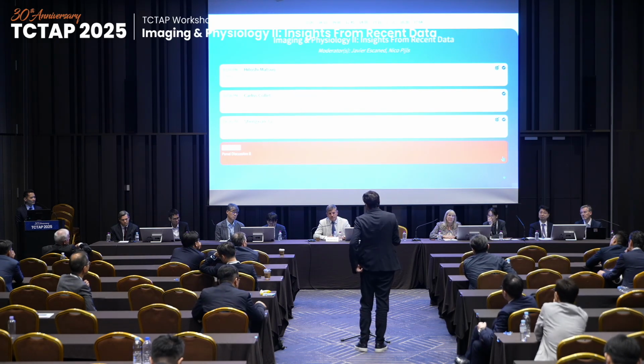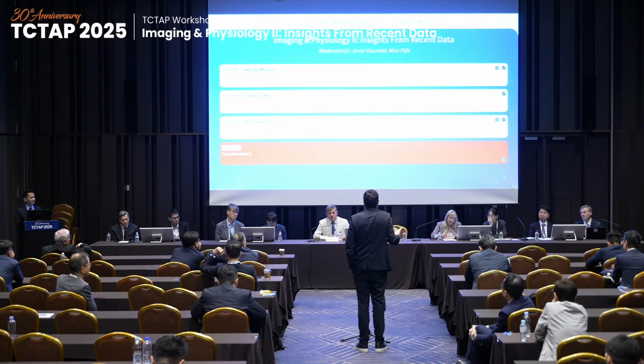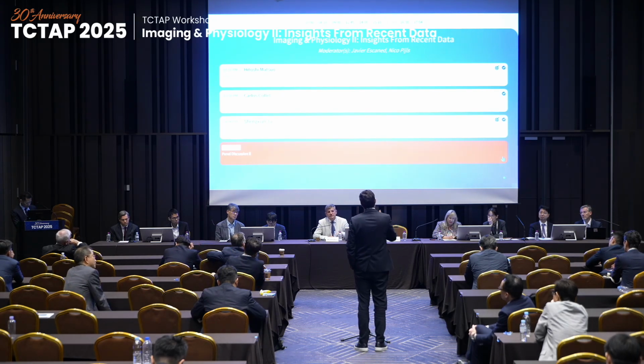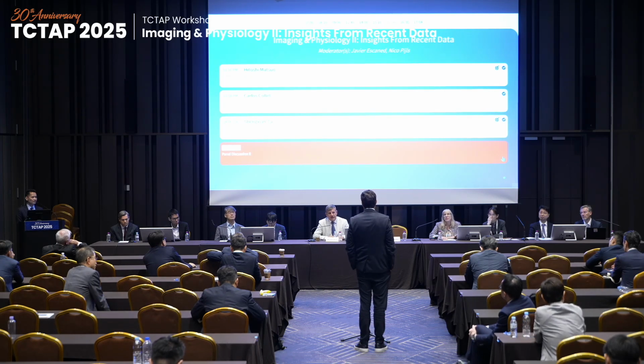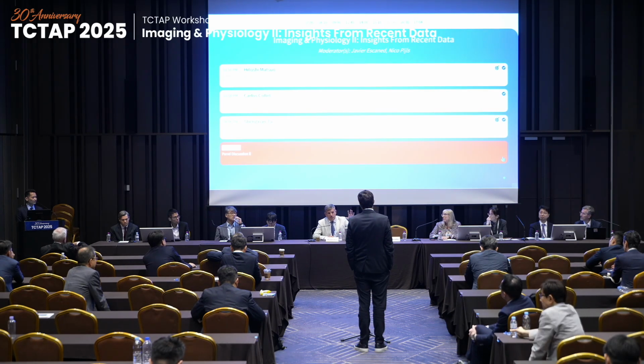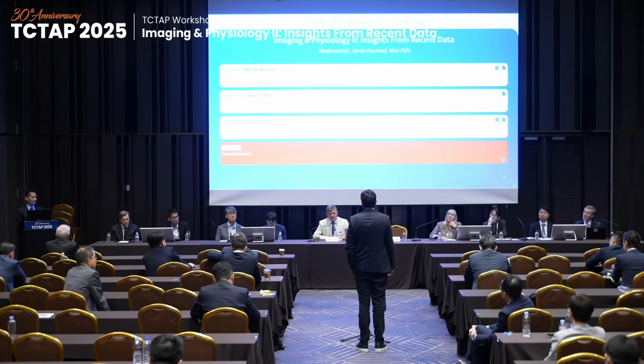You click on the PPG and it comes on the screen. So it's part of the FFR measurement because you have to do a pullback to check the drift anyway. You are just taking information that you were given sometimes for granted as part of the interpretation for the measurement. So it takes, I would say, if you do it very fast, 20 seconds. If you are more calm and relaxed, 40 seconds. And the further analysis is automatically on the screen of the Abbott Coroventis, it's one interplay. Once you have that, you just click on the PPG button, and then you get it in front of you. So you get the PPG, the new platform.